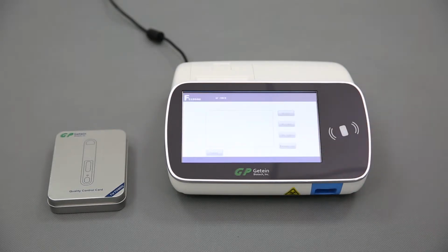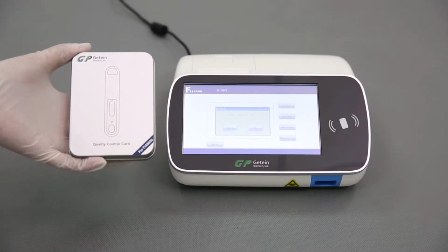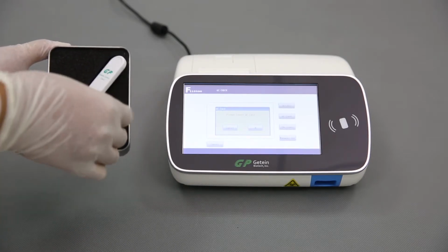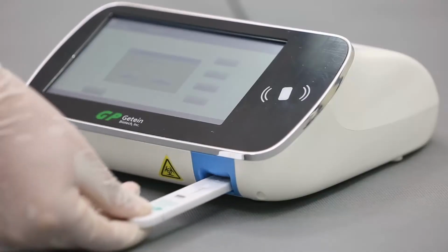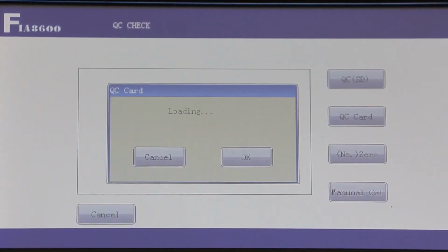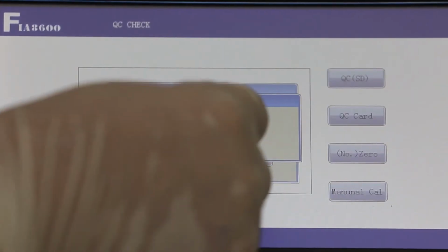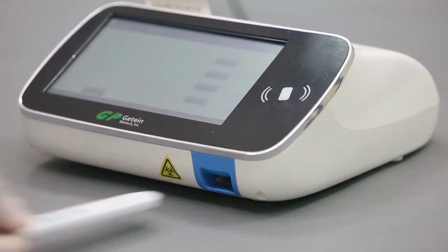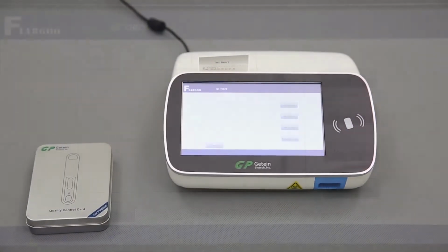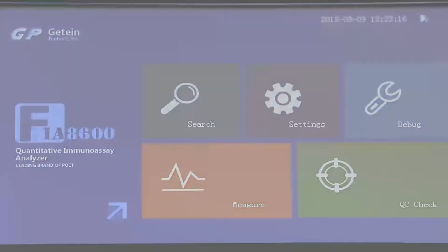Click QC Check, QC Card, and take the QC card out of the aluminum box and insert it in the test port with the arrowhead inward. When you hear a click sound, which indicates that the card is in place, click OK to complete the process. Each analyzer is equipped with only one matched QC card. Please keep it safe. Press Cancel to return to the main interface after finishing operation.